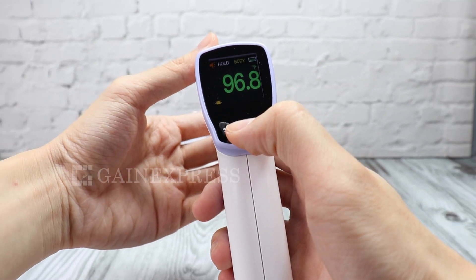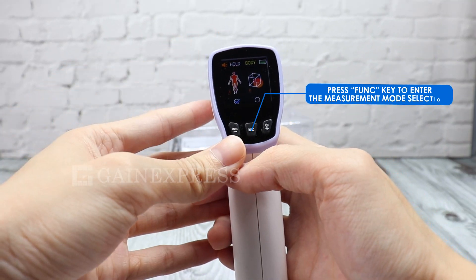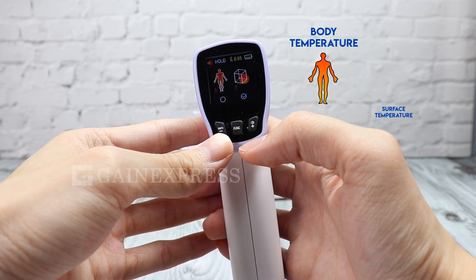To switch the unit between degrees Fahrenheit and degrees Celsius, press the unit key. Press the function key to enter the measurement mode selection, where you can select body or surface temperature.